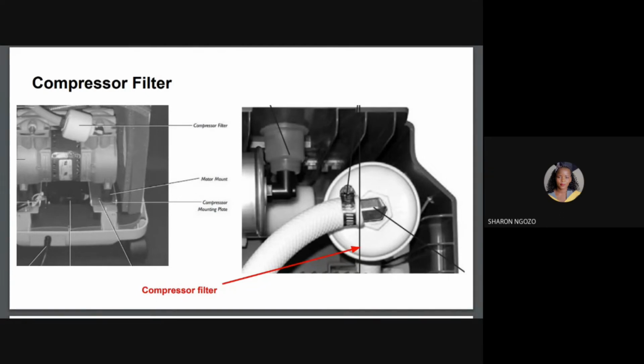However, if the device is being used in a dirty or dusty environment, it may be sensible to replace the filters more often. So you have to regularly check these filters to determine how dirty they are becoming and whether more frequent replacement is necessary. And if it's possible to change them, please go ahead and change.